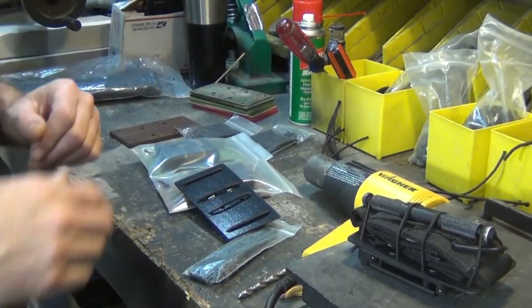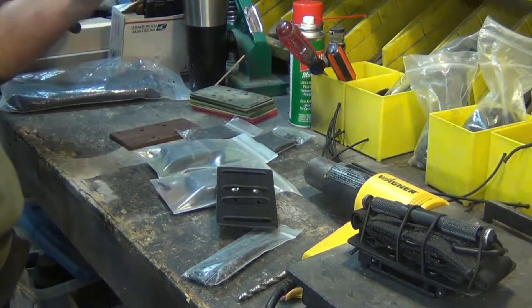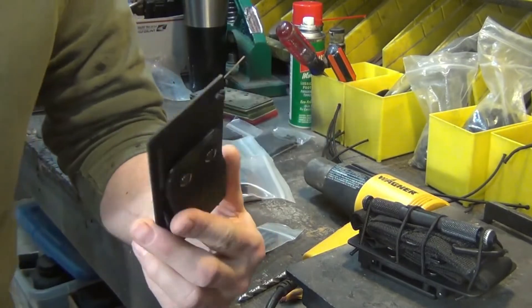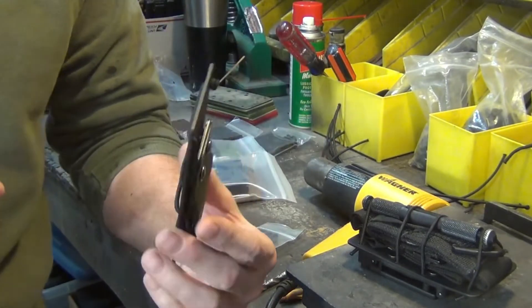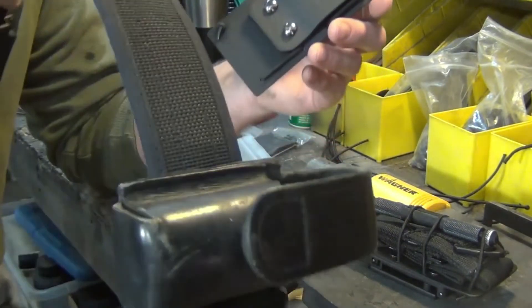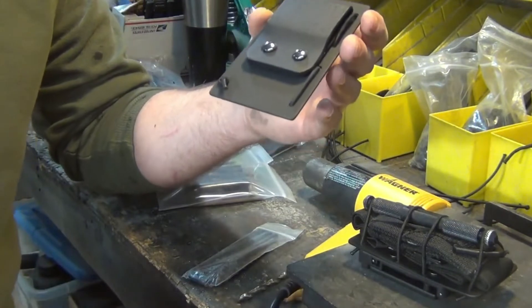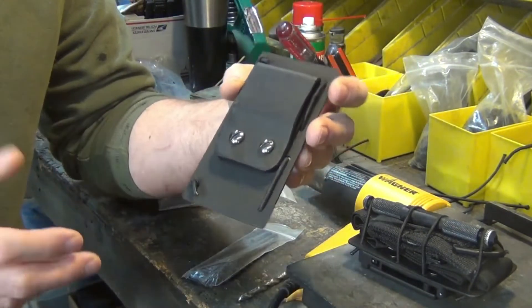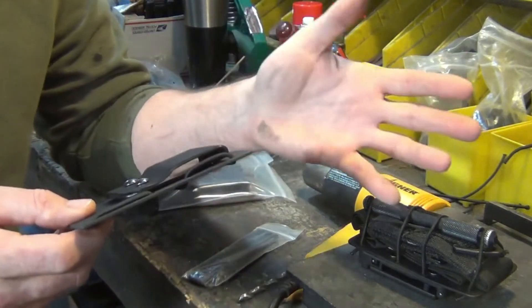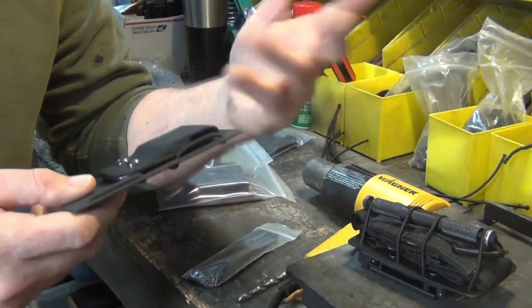Hey guys, welcome back to the channel. I want to introduce the T-card, or tourniquet card. It's something that I make specifically designed for first responders — a way to hold their tourniquet on their duty belt. I have a duty belt right here, and the way I designed it is very simple. You can make these yourself, or I sell them on the website: Three River Kydex. Look for tourniquet card or T-card.